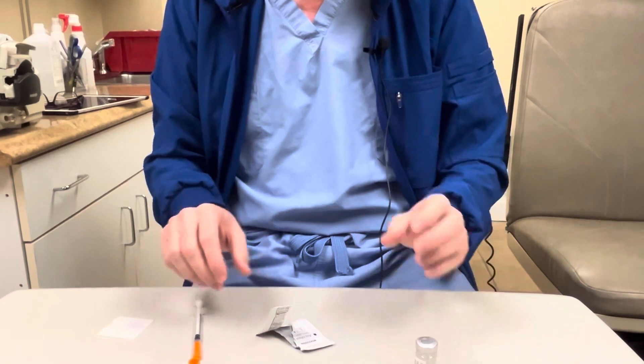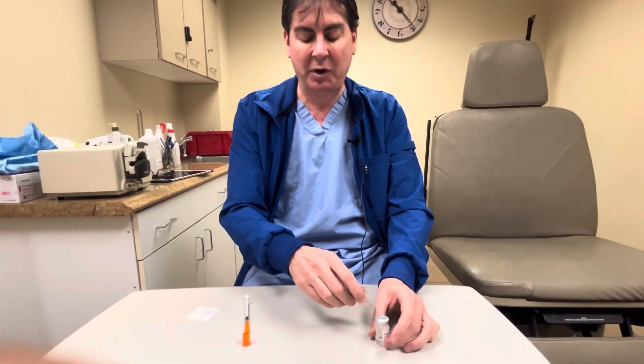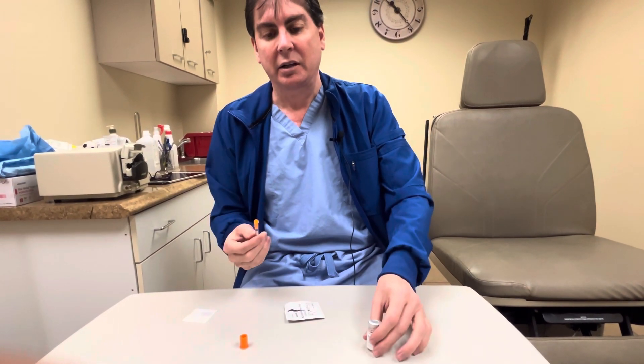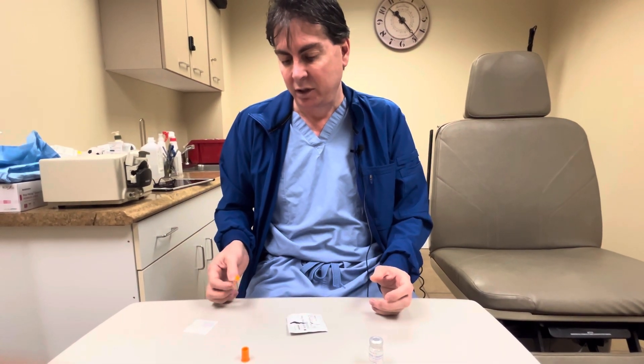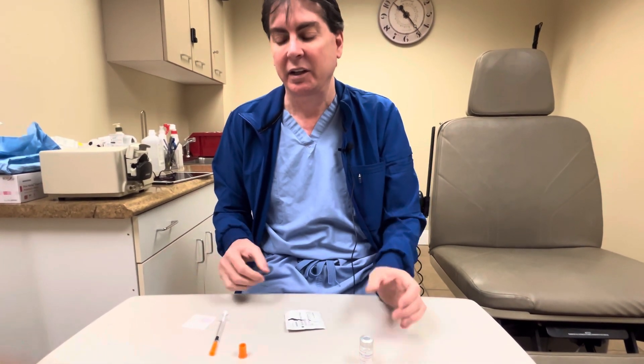Just to recap: number one, cleanse the rubber hub and the area. Number two, withdraw the product to the desired amount. Number three, pinch yourself and inject. Number four, recap and dispose. Number five, stick it back in the fridge and you're done. If you have any further questions you're always welcome to call our office and we'll help you with anything. Thank you.